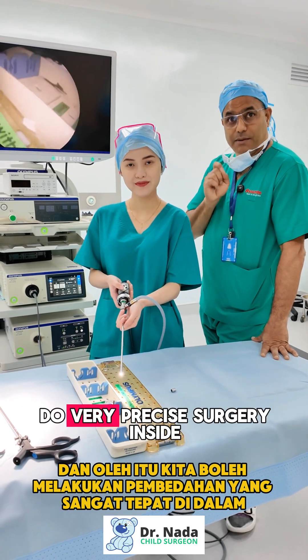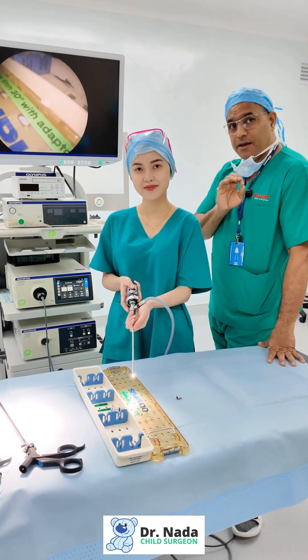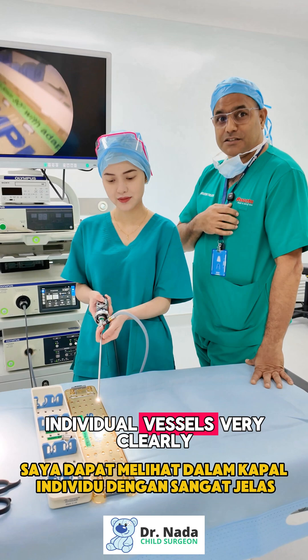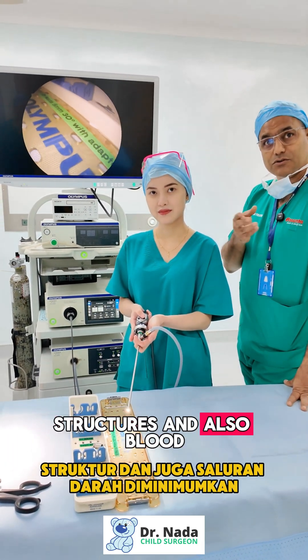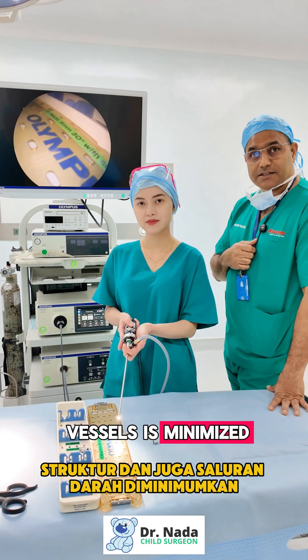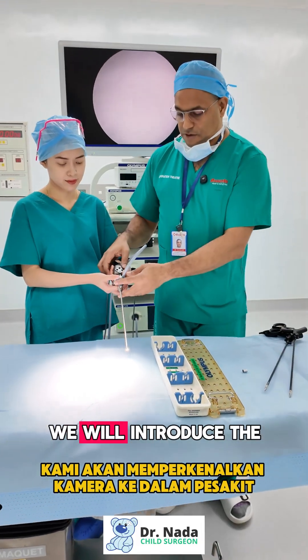We can do very precise surgery inside — I can see individual vessels very clearly, so the risk of damaging structures and blood vessels is minimized. When we do an operation, we introduce the camera into the patient.